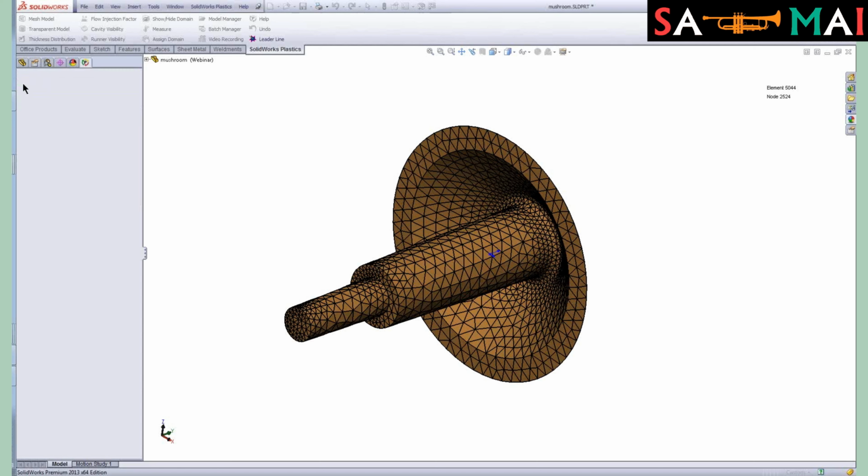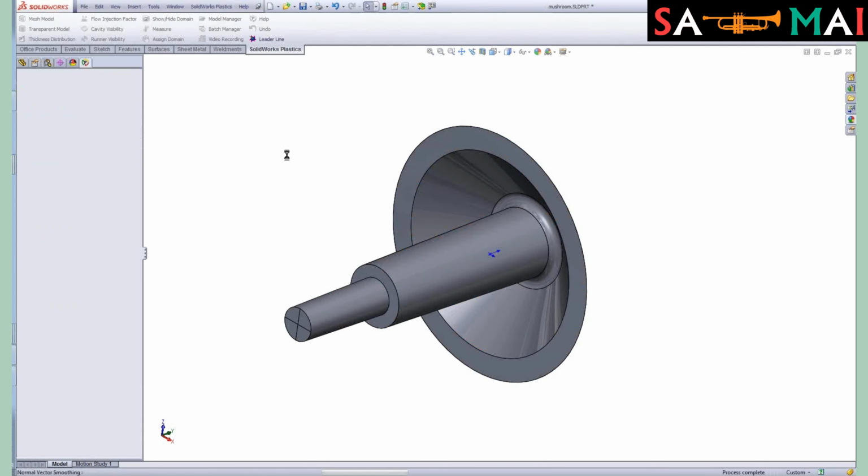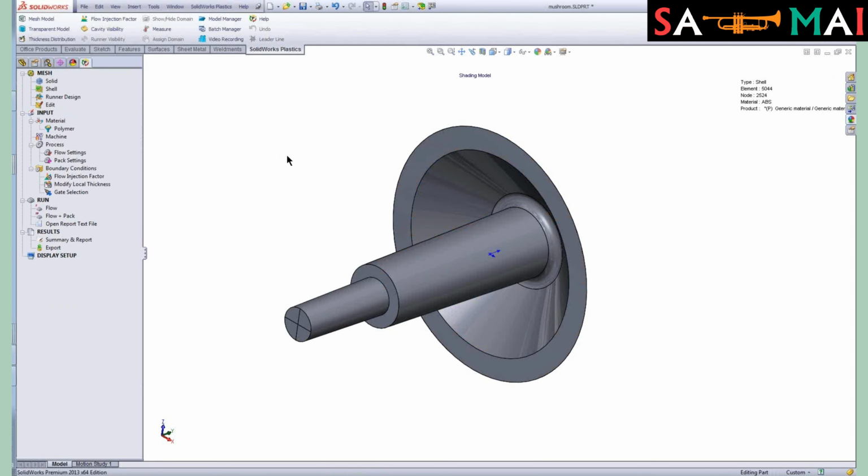Since there's 0%, we'll just continue on. And then because I'm running a license of Plastics Premium, these tools here in this feature manager tree are methods for me to go in and manually modify the mesh. So I have a lot of additional controls above and beyond just meshing this part right within Plastics. So we'll accept that.